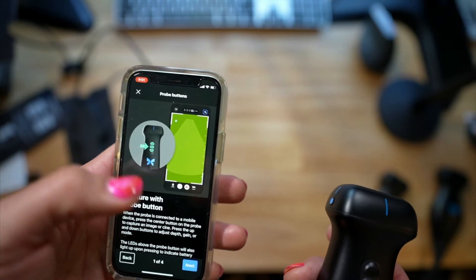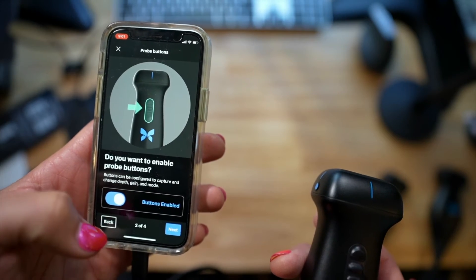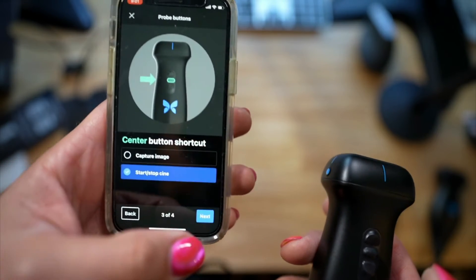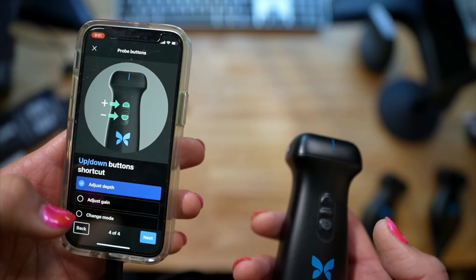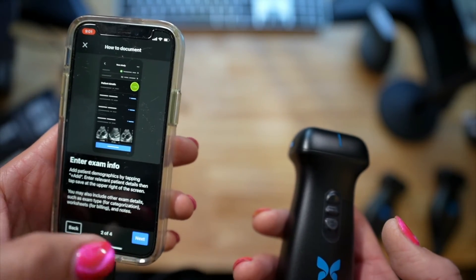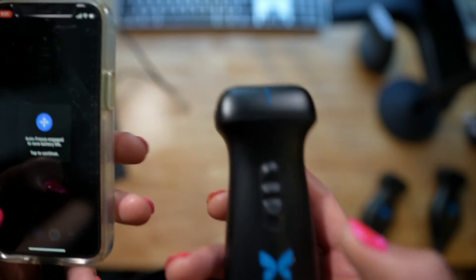It talks to you about how to capture images with the probe, which is huge. We'll enable the buttons here — we'll do start and stop, which is kind of sweet. I like adjust step for plus and minus depth, so we'll go ahead and do that. And enter exam — we don't need that. All right, so we have now been onboarded.